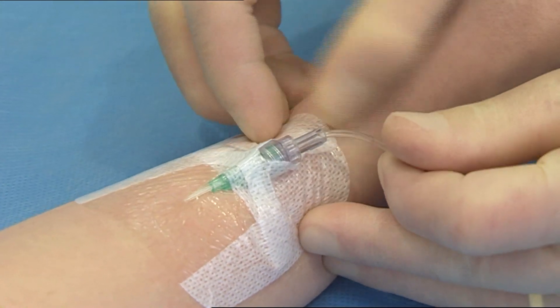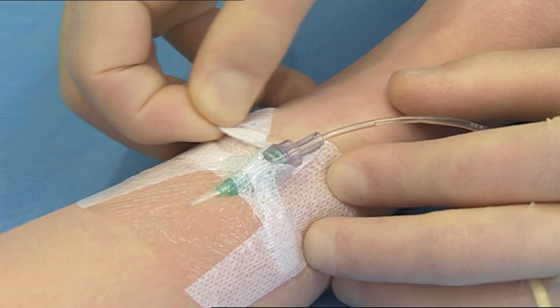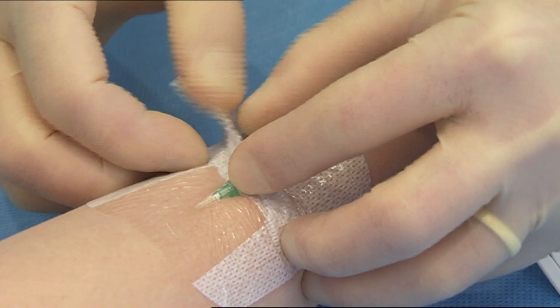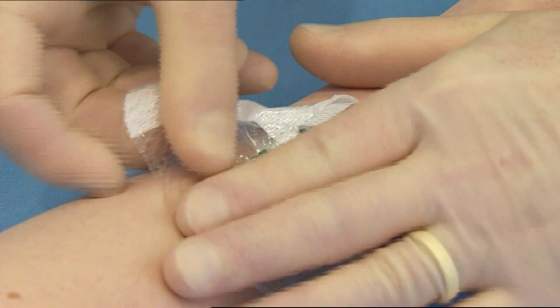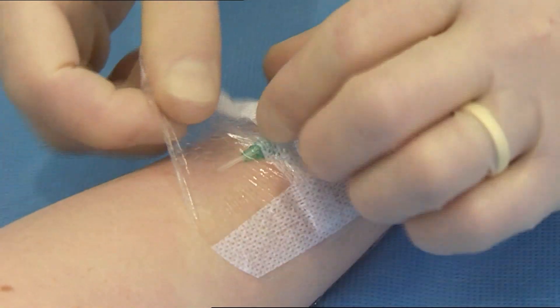Separate the soft cloth section from underneath the catheter hub and peel back the soft cloth towards the insertion site using a low and slow technique. Alternately stretch and release the film section parallel to the skin to break the adhesive bond.